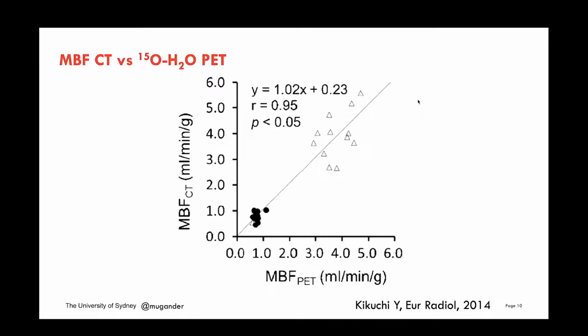So a little bit of a word of warning on the use of CT to quantify myocardial blood flow. Although there are examples of good associations like this one, there's some caution as to what specific post-processing and acquisition protocol you're using, because the devil is in those details, and it's not in favor of the routinely used software, although it's an emerging space, and I'm sure we'll have more to learn about that as time passes and development evolves.